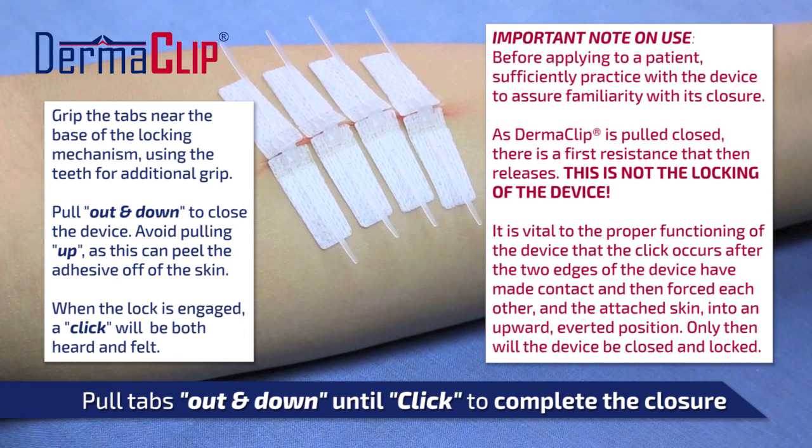Additionally, for those unfamiliar with the device, double-check that the lock is fully engaged by giving an extra solid but smooth pull and check that the angled faces are in a near-vertical position. It is recommended that first-time users test a few devices to ensure they are comfortable with the locking action before using on any patient.